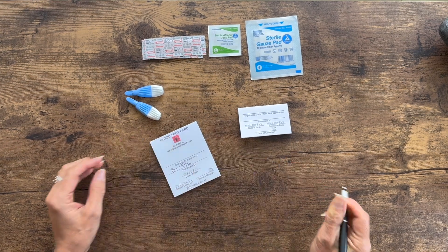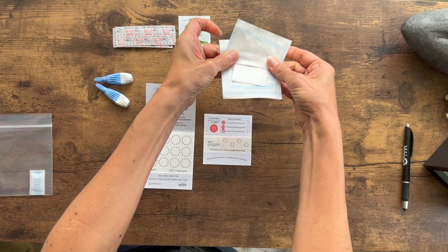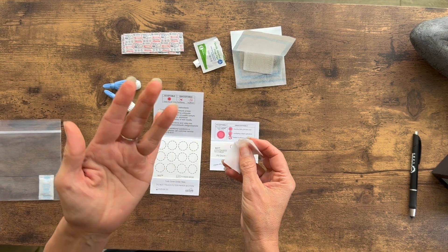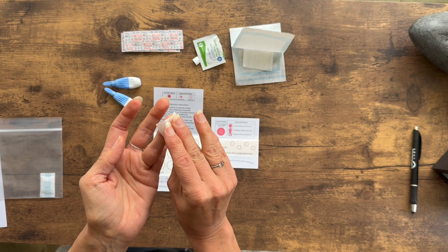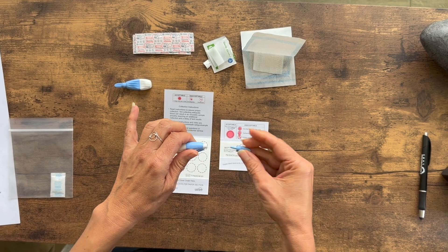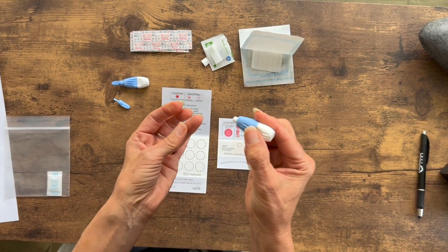When you are ready to take your blood samples, open the blood spot cards, get your gauze ready, and wipe your fingertip with the alcohol wipe. Choose a finger from your non-dominant hand. Twist the cap off of one of the lancets, place the tip of the lancet on the tip of the finger, and gently press until it clicks.